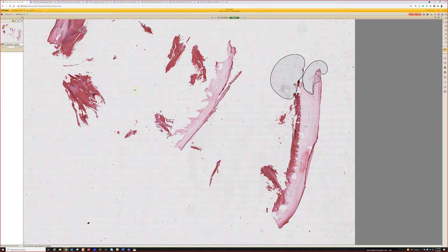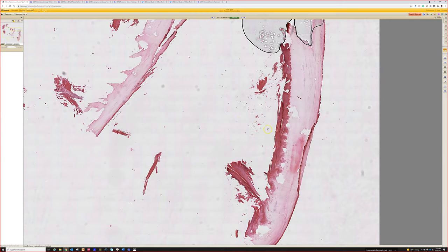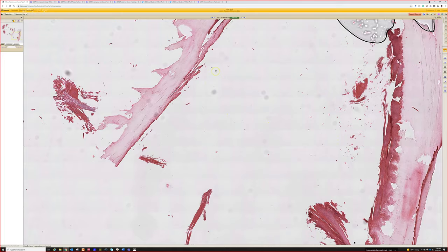Case four. What kind of specimen is this? It looks like a nail clipping.